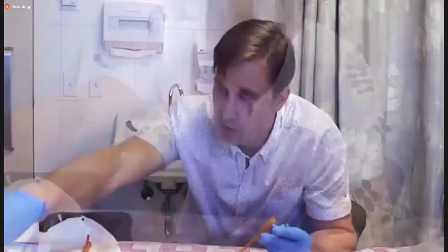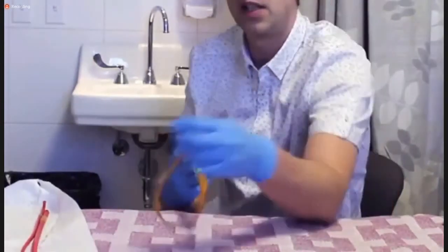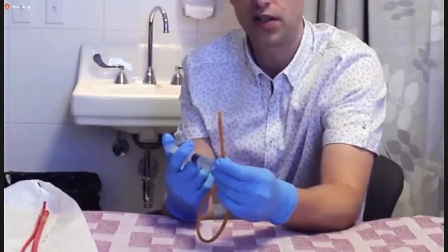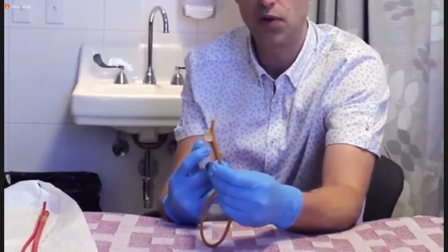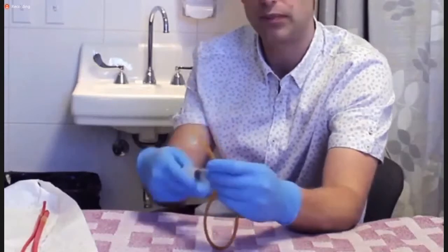So, just to demonstrate, if I inject a syringe with fluid or air into this catheter and you inflate it, you will start to notice that this balloon inflates. And as that balloon fills to usually about 10 cc's as a standard, this balloon is what holds the catheter in place while it's in someone's bladder. So that's the basic anatomy of a catheter.